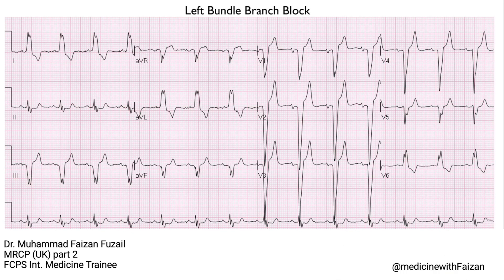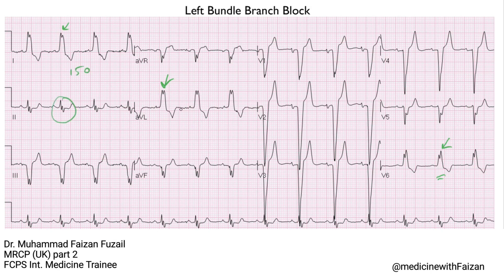Now let's look at an example. This is a 12-lead ECG where you can see some notching in Lead I, AVL, and V6. The transition is a bit late — you can see a QS pattern all the way across the precordium, and it's not until V6 where it becomes this typical positive upright notched pattern. The QRS complex is clearly wide, about 150 milliseconds. There is left axis deviation and absent septal Q waves in the lateral leads, and there is no R wave in V1 or V2 as well.